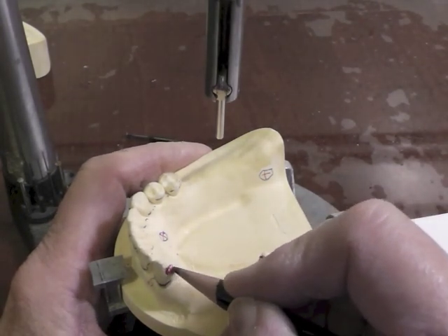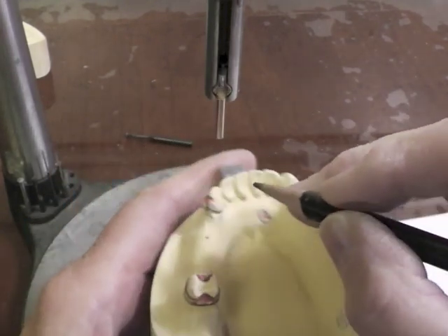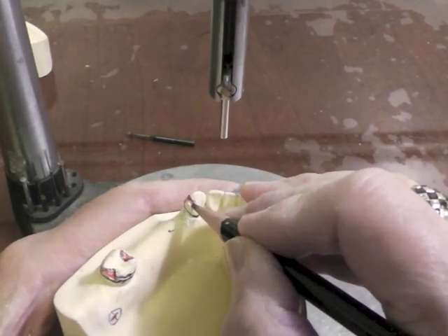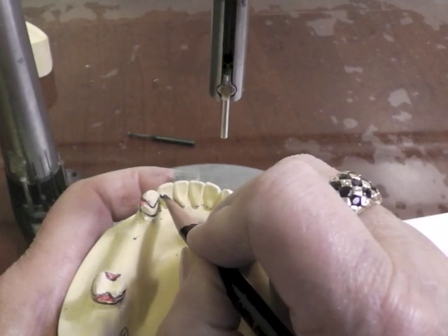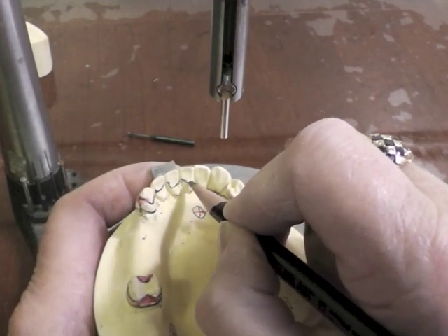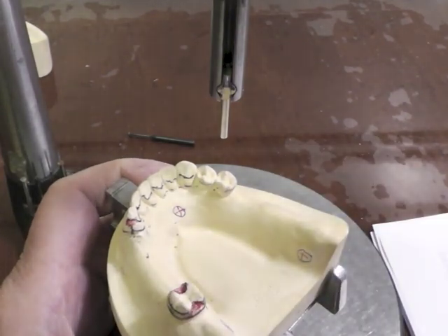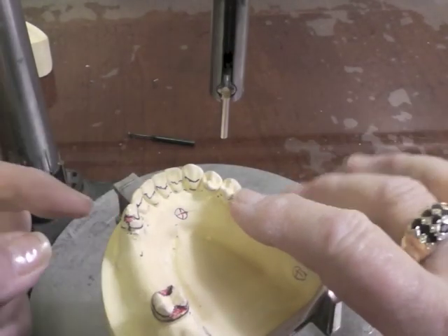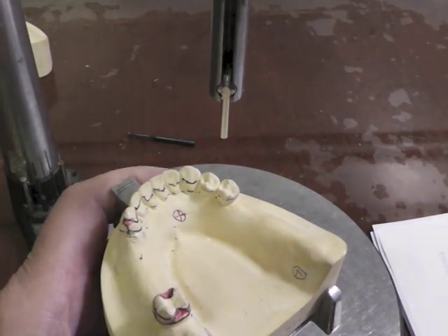So my rest will come down like this. This edge of it will become my guiding plate. This part that comes over the top will become my lingual plate of my major connector. And while I'm at it, I'm going to go ahead — I'm closing that embrasure, covering the cingulum, go up to the contact point, cover the cingulum, up to the contact point, cover the cingulum, up to the contact point, and right up like this. Now I might choose to put an additional rest over here because my major connector is going to be quite long. If I wish to, I could put another rest in the mesial fossa. We'll see what we get as we go.